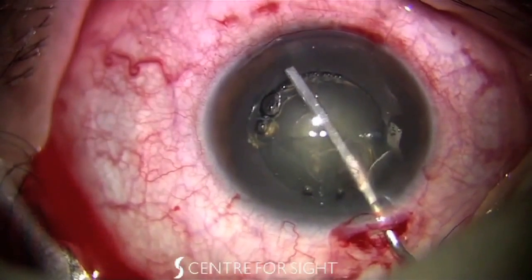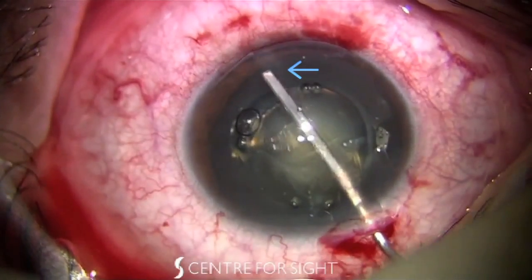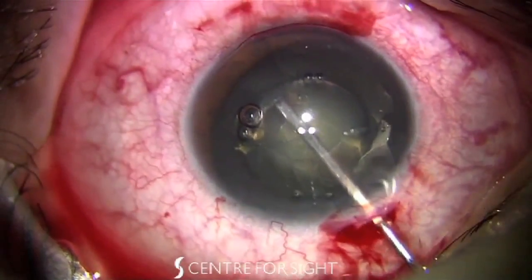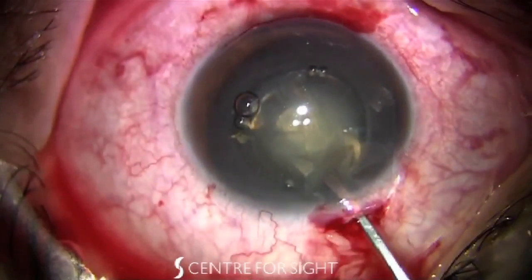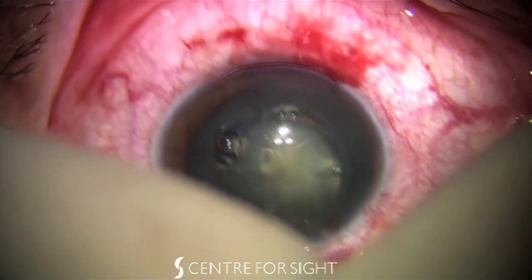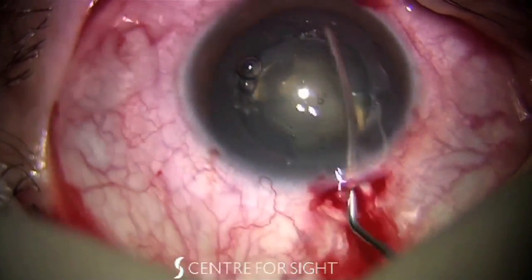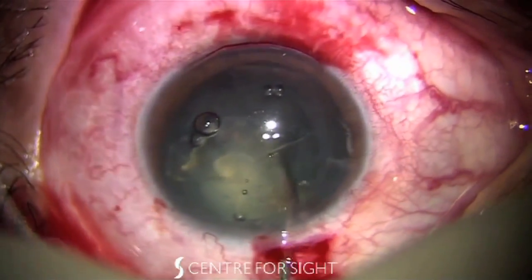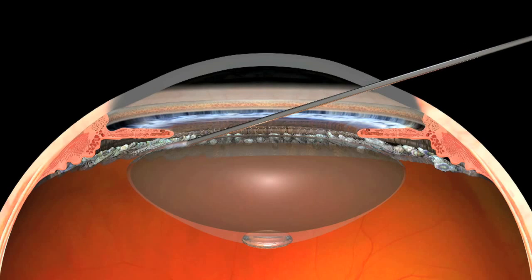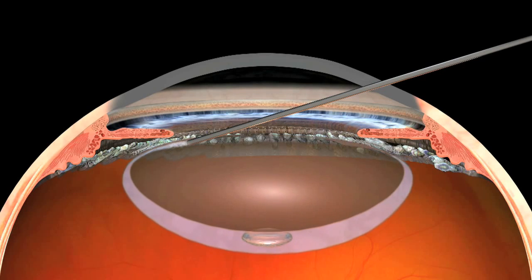This video shows difficulty in passing the hydrodissection cannula immediately under the capsule, with the cannula riding over the edge of the capsule. The cannula eventually does insert under the capsule, and when fluid is injected, capsular block occurs with fluid accumulation behind the lens and anterior displacement of the nucleus. Notice how the lens pushes up against the anterior capsulotomy, widening the opening. The lens is difficult to rotate and needs to be rocked to release the fluid. This animation illustrates the phenomenon of capsular block, again showing distension of the posterior capsule and forward movement of the nucleus.